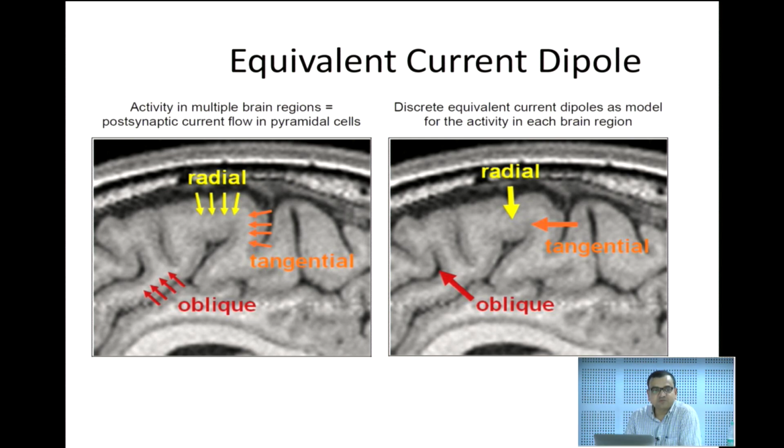And what you primarily want to achieve is, from the scalp space, to get better information about the ECD. We cannot model or recover activities at the individual neuron level from the EEG, but we can talk about a reasonable cortical patch, which is modeled by the ECD.